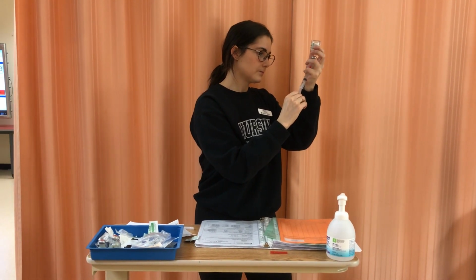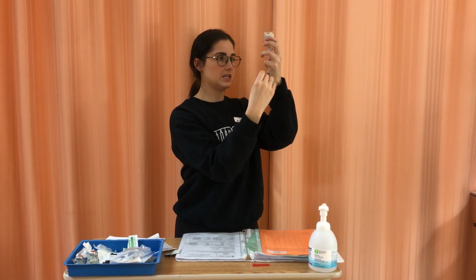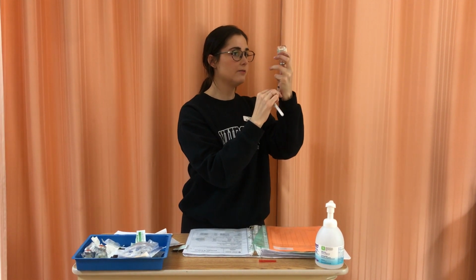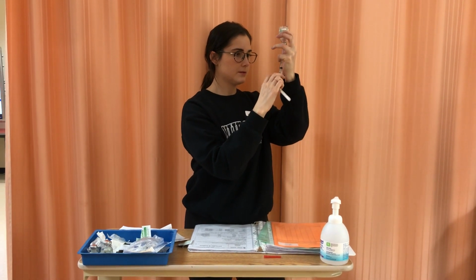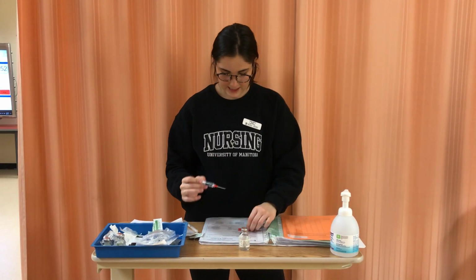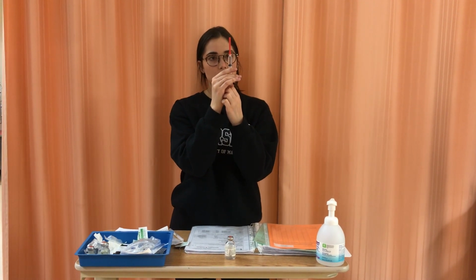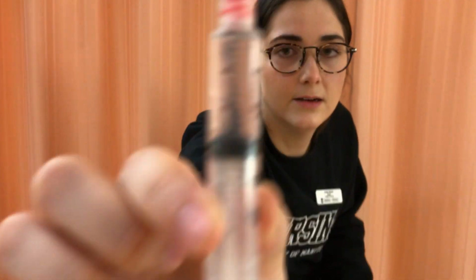Perfect. So just tap out the bubbles, ensure we have the correct amount of medication. Just going to calibrate this so that we have enough. Okay. So we're going to cap this. We're just going to pull back and make sure we have the correct volume, which we do. Okay, so I'm going to show the amount. So that's 3 milliliters there.